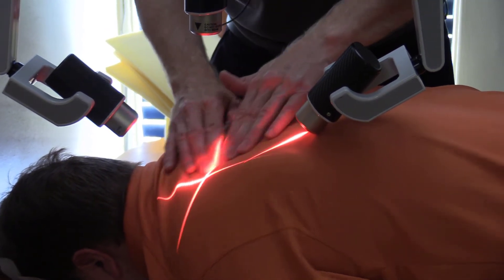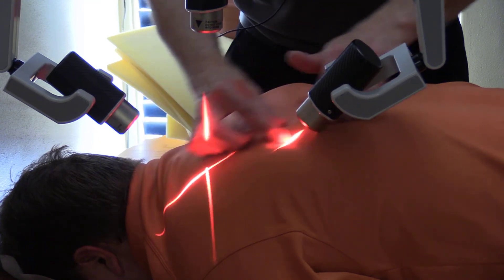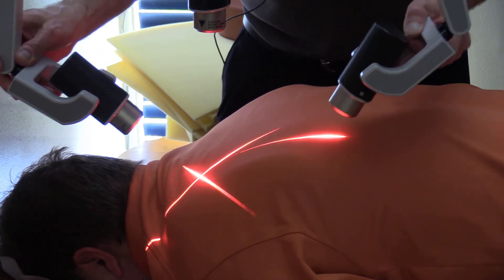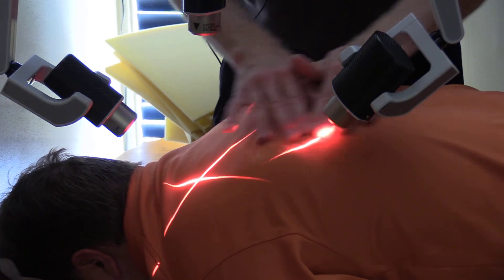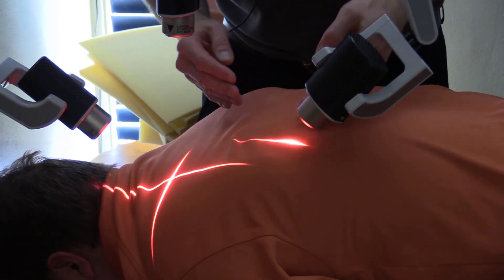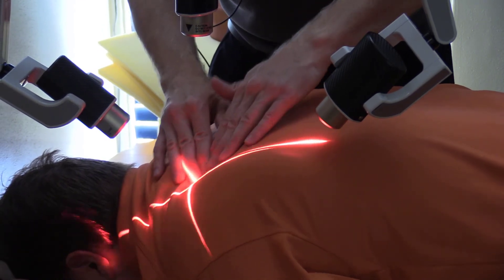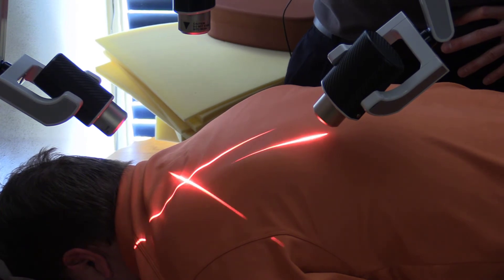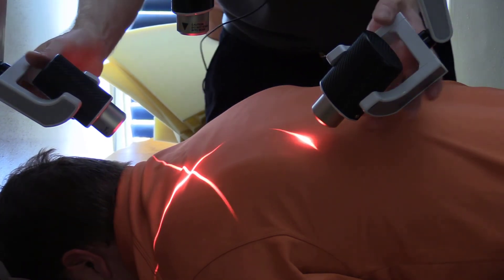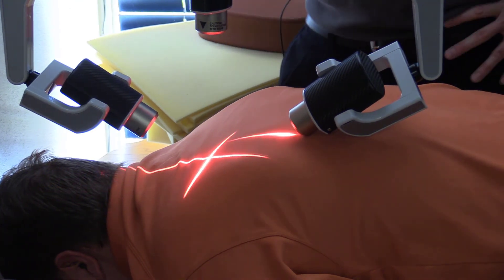You just go through and lightly feel, and you can feel the ropey fibers going up and down. Since the erectors are more superficial muscles, you can go at a slight angle trying to get more length versus depth — it just depends on what you're trying to do. That would be a great spot to leave them there for 20 to 30 minutes and let that work. If they're going longer, just come in and shift the lasers around a little bit and keep going after different things.